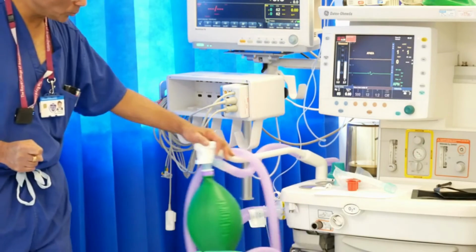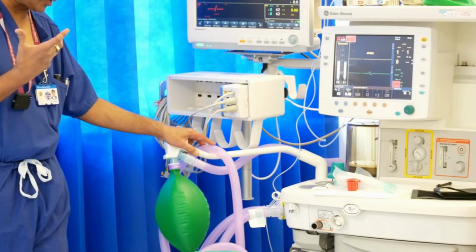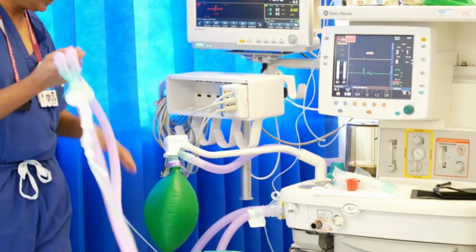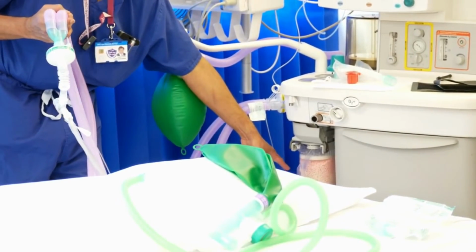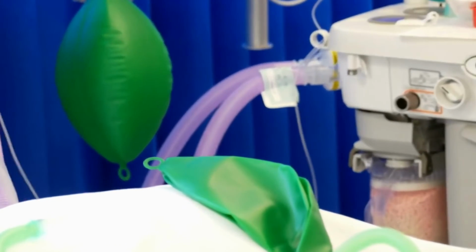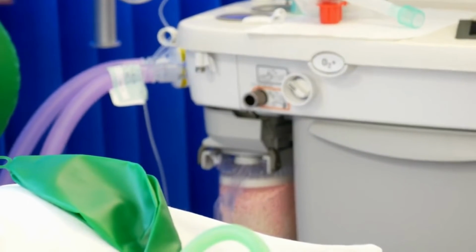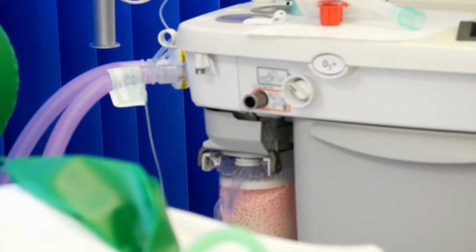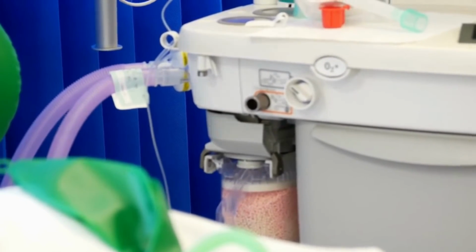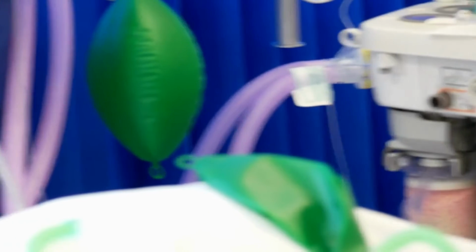All that? No. Normally, this circuit has a canister called a carbon dioxide absorber, which absorbs the carbon dioxide coming out of your breath and recirculates the rest of the gases into the patient. That's why we call it a closed circuit, where we can conserve oxygen and protect the environment as well.